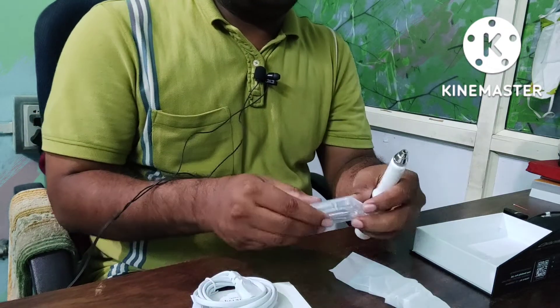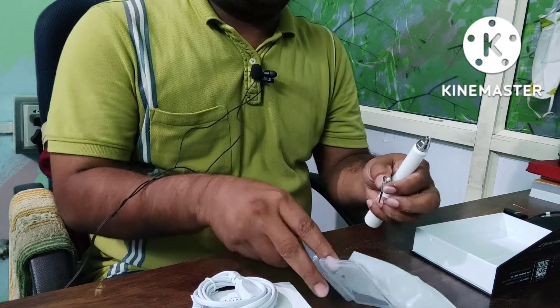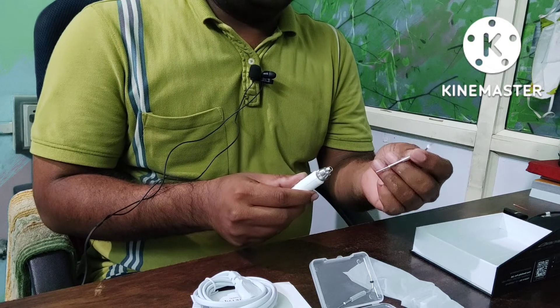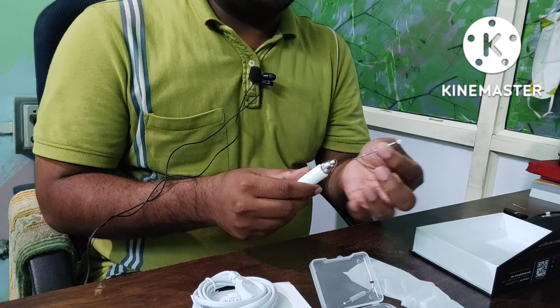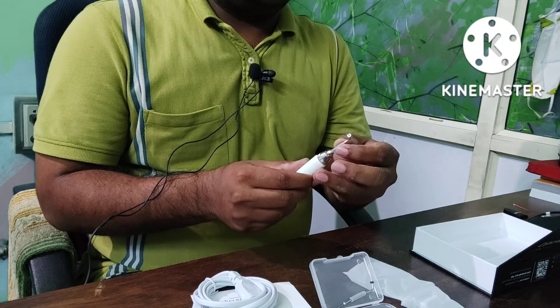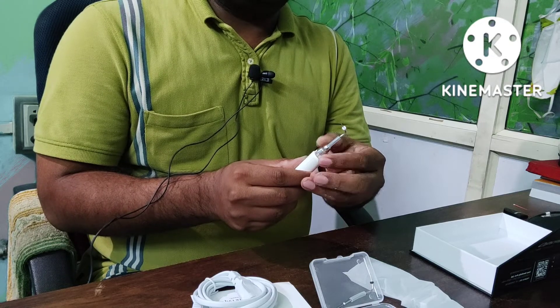So let's take a demonstration. Firstly, loosen it, then insert. This pin is there — just insert the pin. There is a handle, a plastic handle is there. Hold it with the plastic handle, just insert here. It will go up to its entire length. Then just tighten the screw.